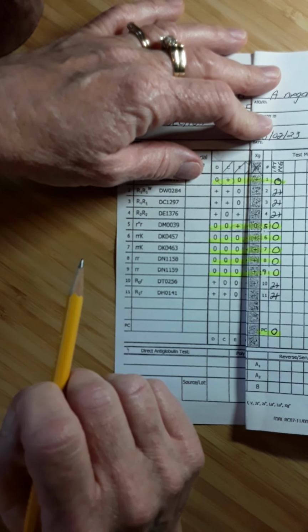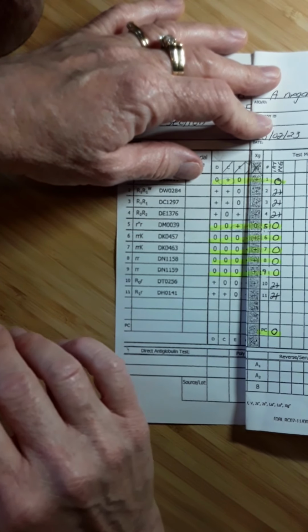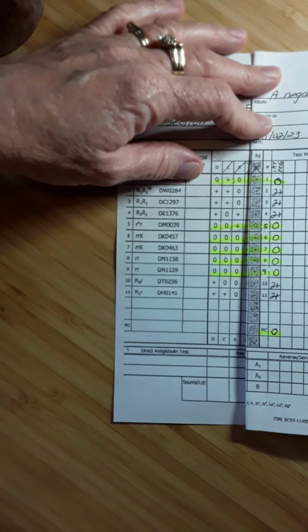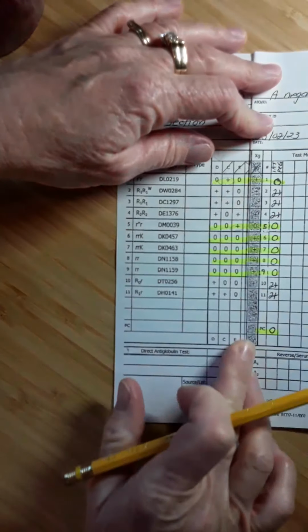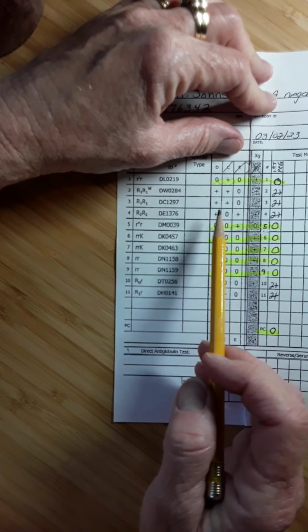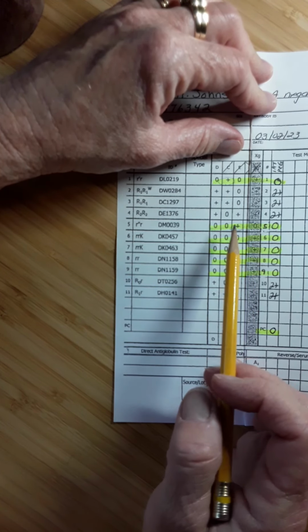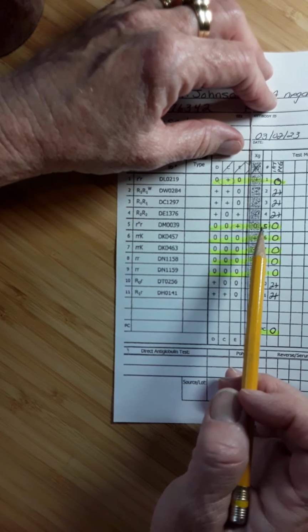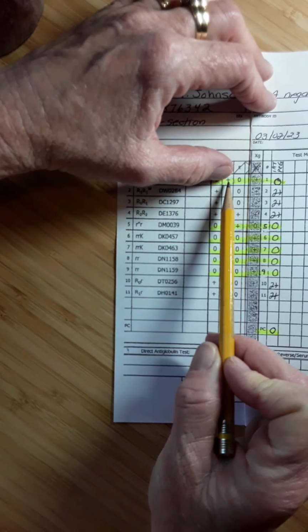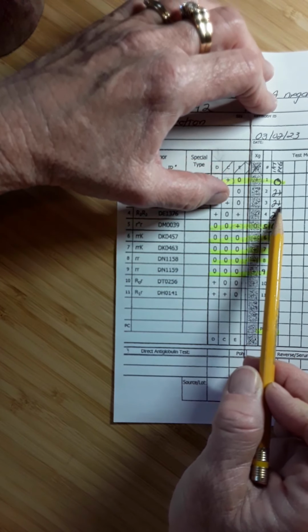Pattern recognition? So notice all the work that we did before we got to the point where we were going, oh, look at that. The pattern matches an anti-D. It doesn't exactly match the pattern we would expect if the plasma contained an anti-big C. If the patient's plasma contained an anti-big C, we would actually expect a positive reaction with the first cell, positive with second and third, which we did get.